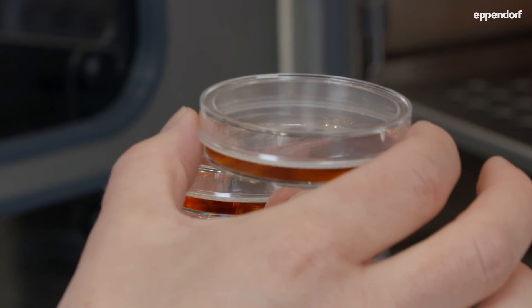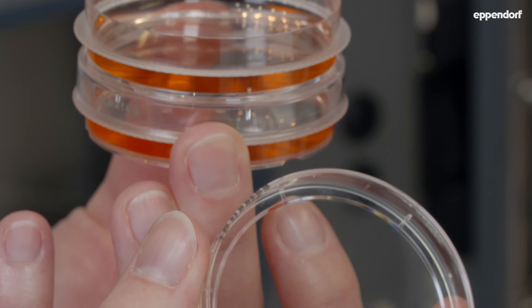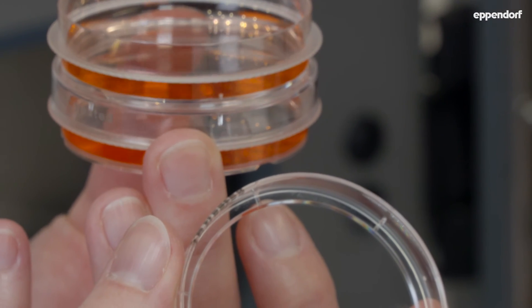The Eppendorf cell culture dish offers a handling ring for a safe grip and avoids unintentional removal of the lid. In addition, the lid is equipped with a splash protection ring. This ring avoids splashes during transportation and also traps liquid inside the dish when condensation occurs.